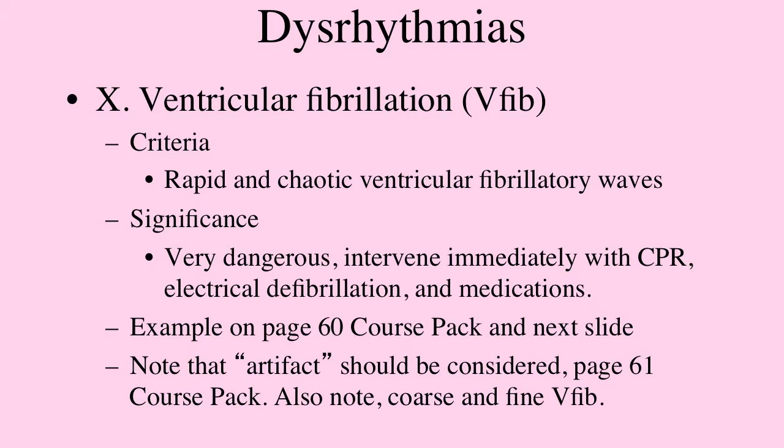Okay, the next one is ventricular fibrillation, and VTAC we said was bad. Ventricular fibrillation is actually worse, in that there is no person in ventricular fibrillation that is anywhere but on the ground and has a blood pressure of 0 over 0 all the time. Again, we don't take the time to say the full name. We usually just say VFib, and the criteria would be rapid and chaotic ventricular fibrillatory waves, where you just have a kind of a shaking of the entire heart, ventricles, no cardiac output.